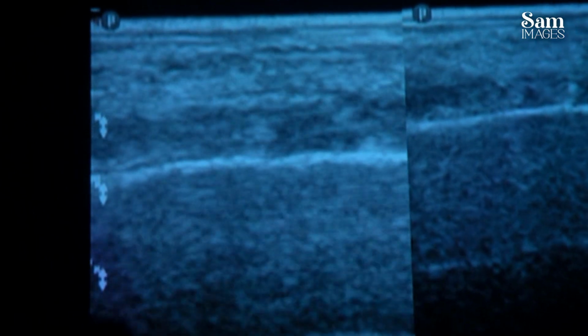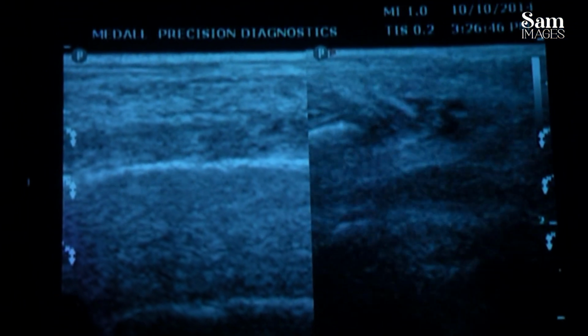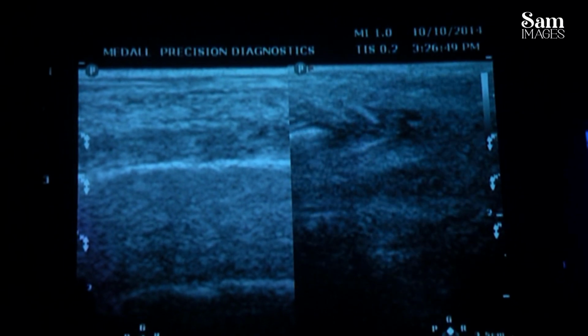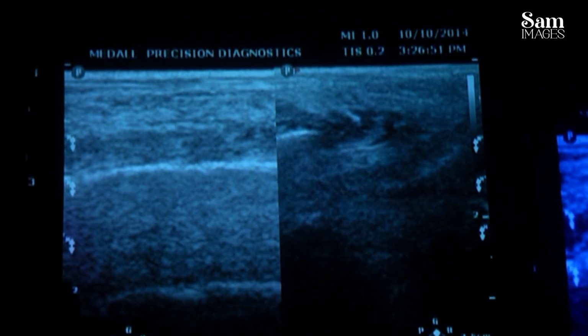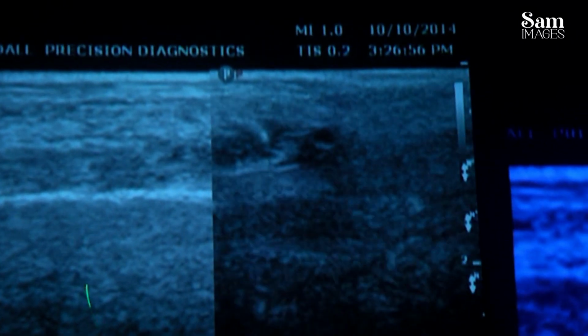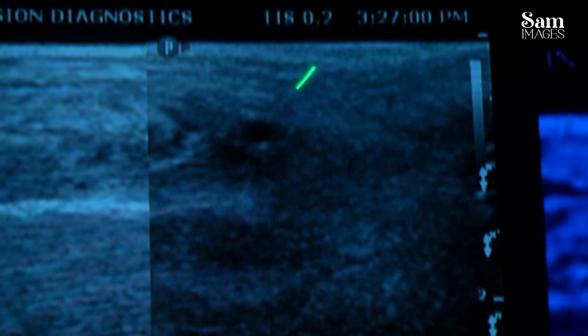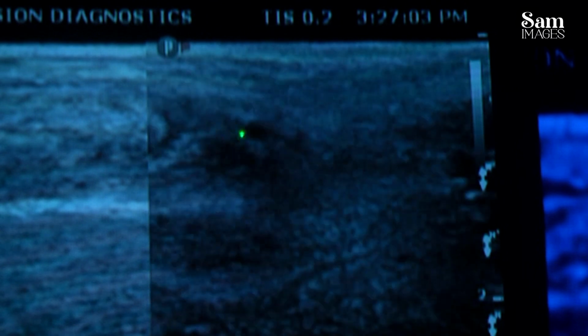Stop. Okay, I'm just palpating the lesion here. You see the difference? That's a periapical lesion. I am telling you to observe it in a dual position, that is, in the split screen. You can appreciate that periapical abscess there, a hypoechoic area, right? And that is the lesion.